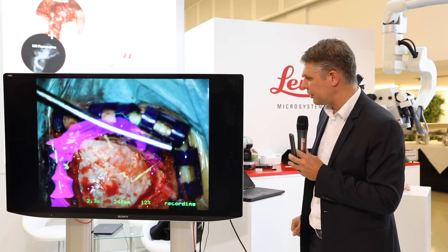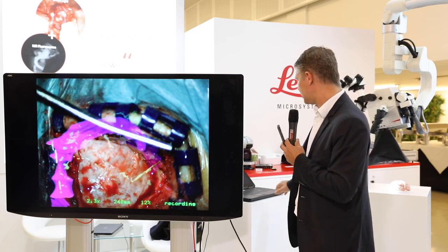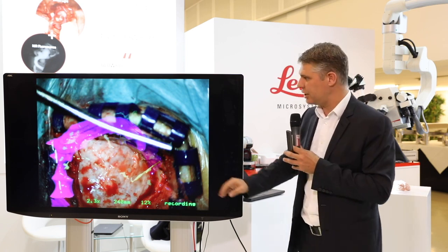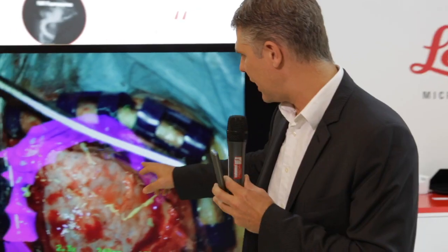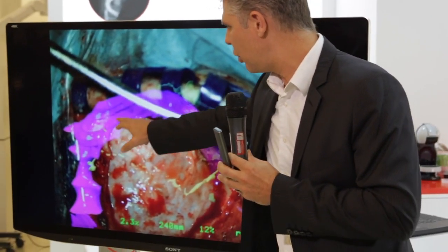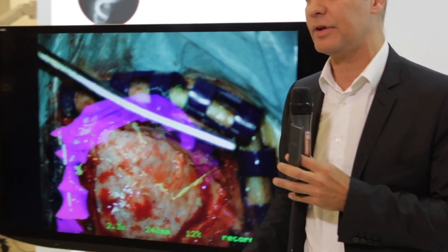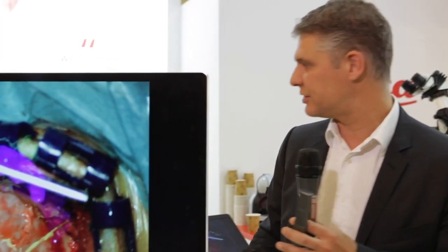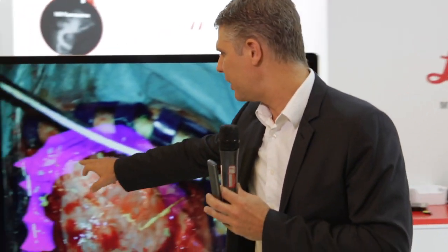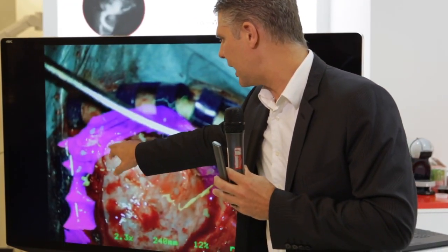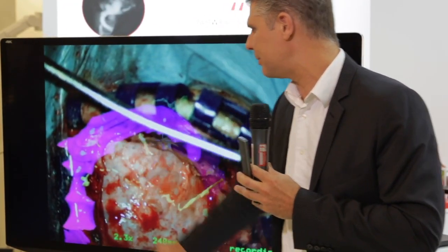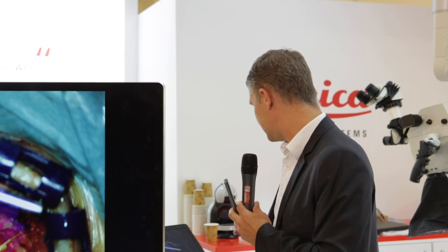Just prior to opening the dura, we were able to open very carefully and very close to the sinus, and exposed a little bit of the sinus to show that the navigation is really accurate.